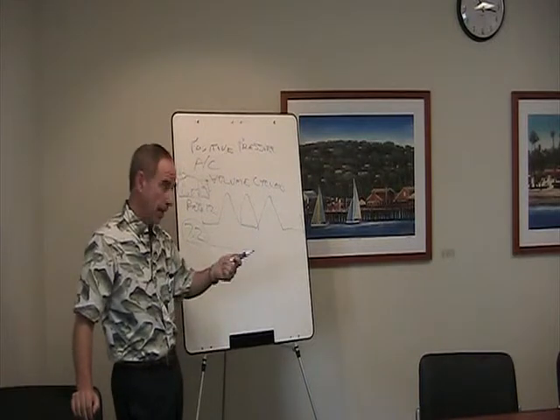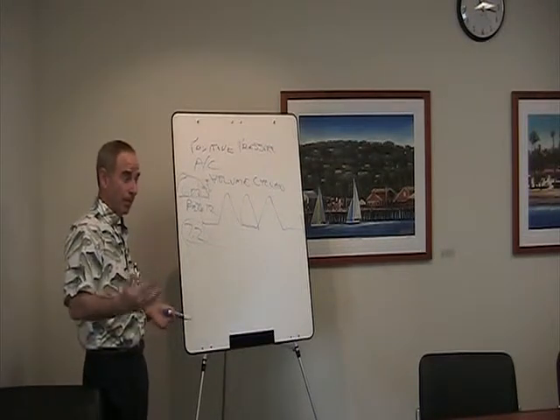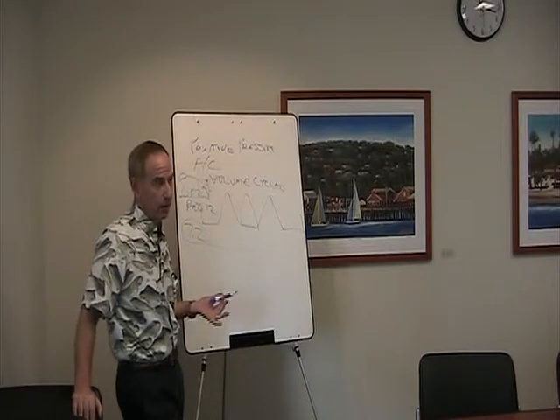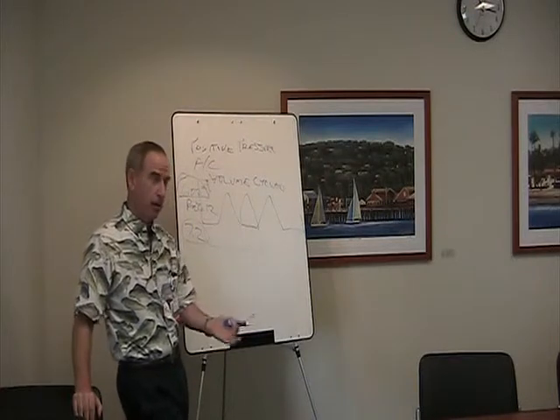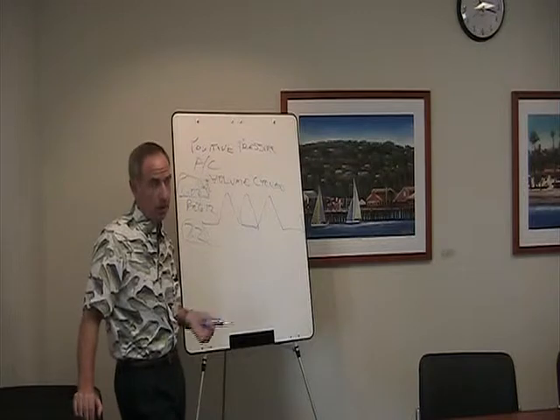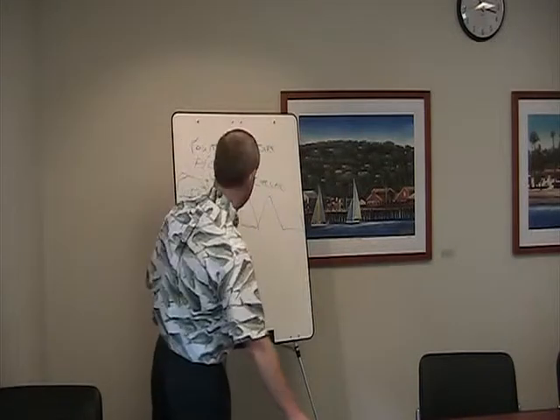Decreasing the volume might help because that will decrease the amount of volume with each breath. They may compensate by breathing even faster, or they may not, but that's one thing you could try. The other thing is just to sedate them more, so that they're not breathing so fast. You don't necessarily have to go all the way to paralysis, but you can sedate them so that they don't have that high rate. And like you said, the other thing is to switch them to a totally different mode of ventilation.